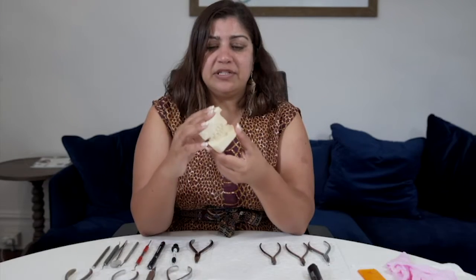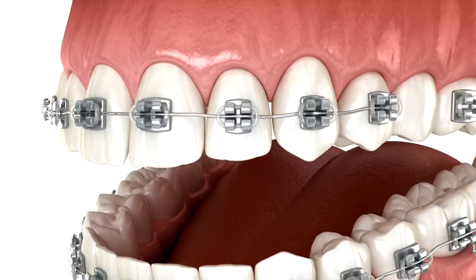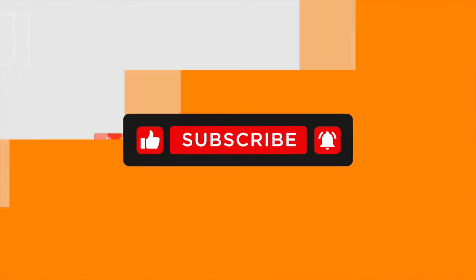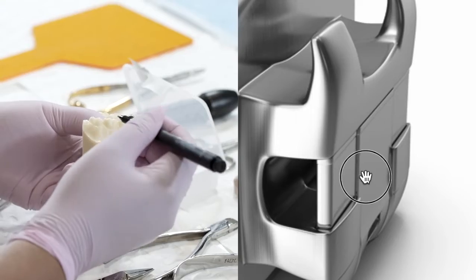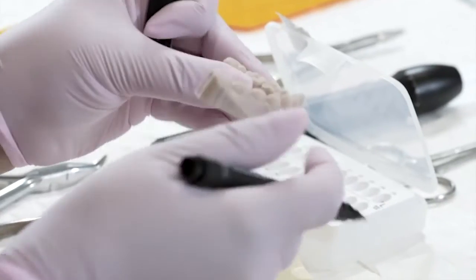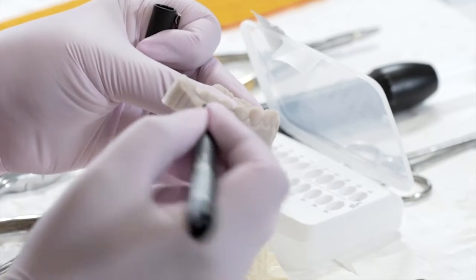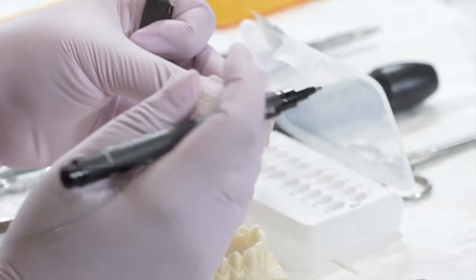I've got two typodons here and we are looking at bonding brackets. The first step in bracket bonding is getting your long axes and horizontal axis right. Looking at this model — this is a growing child — you can see the molars and premolars still haven't erupted, so if I were bonding a bracket here I would go more gingival to help it erupt.